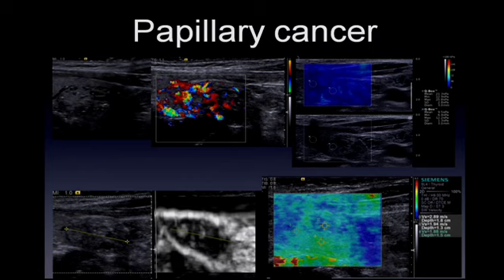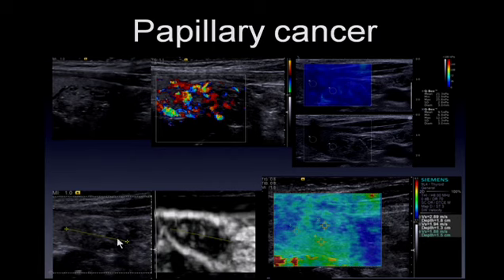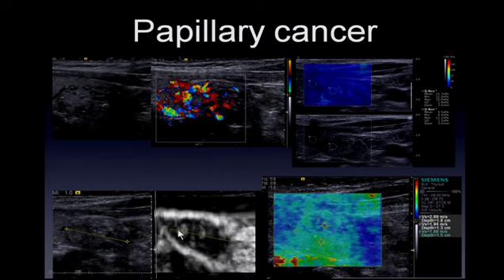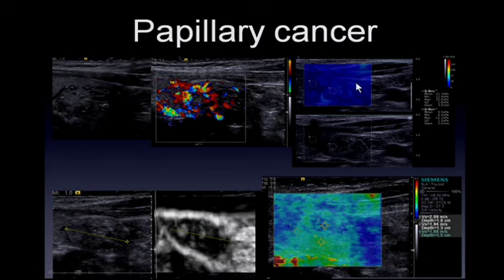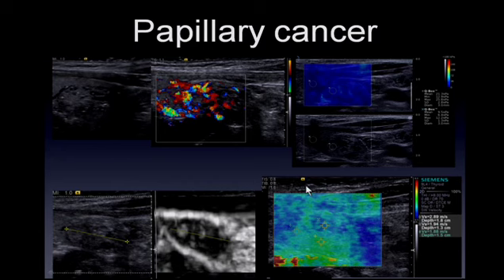This papillary cancer has very characteristic B-mode images, being very heterogeneous with multiple calcifications throughout and extremely vascular on color Doppler. On strain imaging, the lesion itself is hard with some softer areas within it, though a strain ratio was not performed. On shear wave imaging, velocities are approximately 3 meters per second, and on the supersonic system approximately 22 kilopascals—based on the literature, these would have been predicted as benign.